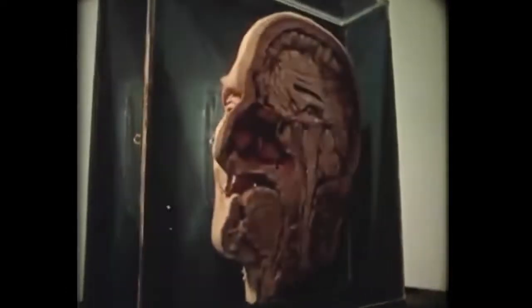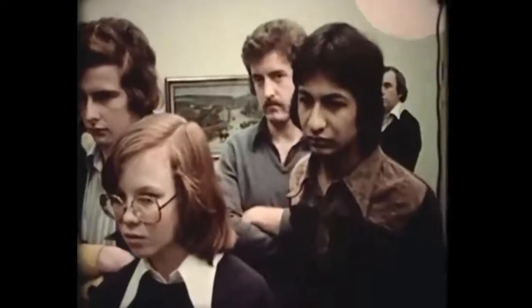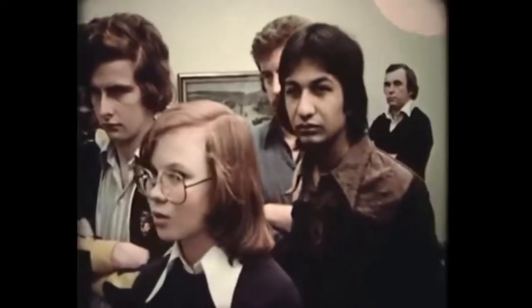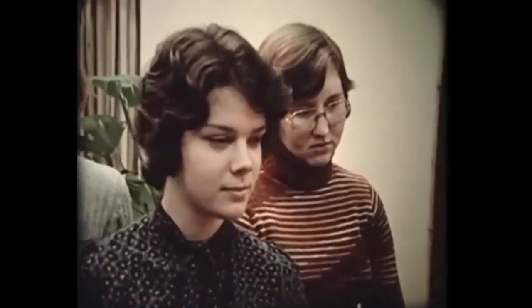Medical students the world over have long learned about anatomy by studying the dead. Mr. Chadwick's had a problem. At Manchester University in Britain, CT enables Professor Isherwood to show his students the anatomy of a live subject. Some abnormalities which may be related to the pancreas, and we're going to investigate those this morning. Now, Mr. Chadwick's going to have a computer tomographic investigation on the EMI whole body scanner.